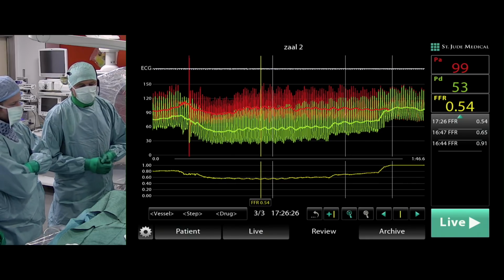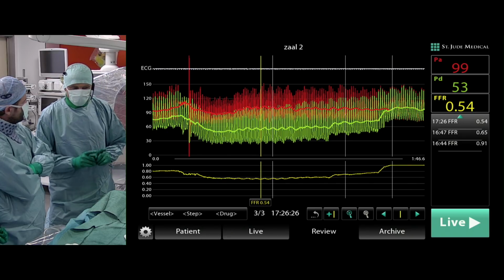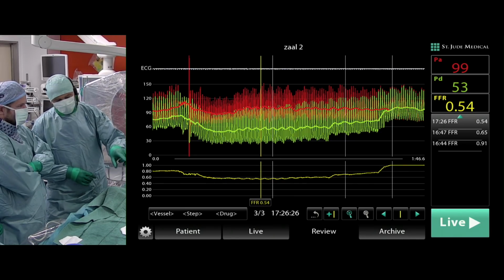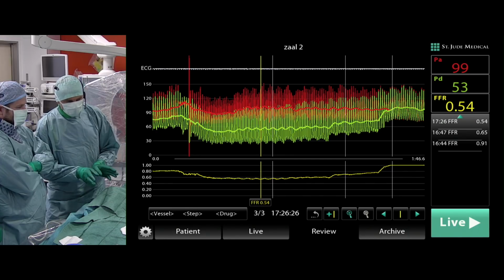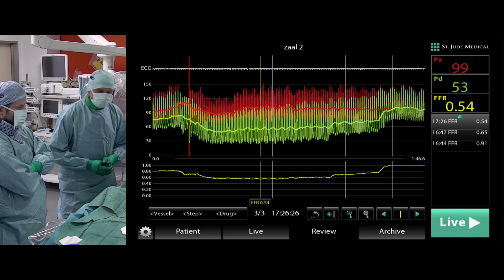Again, this is classical. This is nothing new, but I think it is important to see it. And another detail, I'm sorry to be too talkative, is that this recording is what I could call a nice, perfect recording, which means first the pressure gradient at rest without doing anything, then during 10 beats, 12 beats, then you inject the adenosine or the papaverine or whatever, and then the recording, and then back to the baseline.